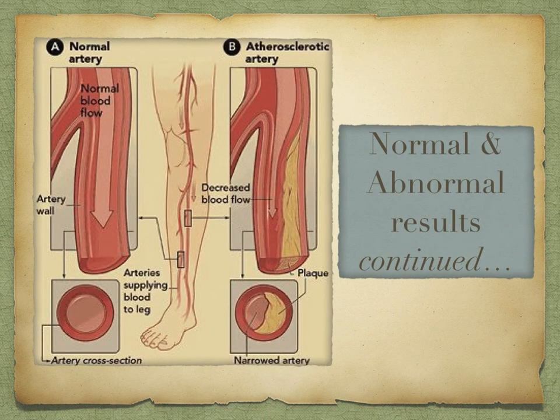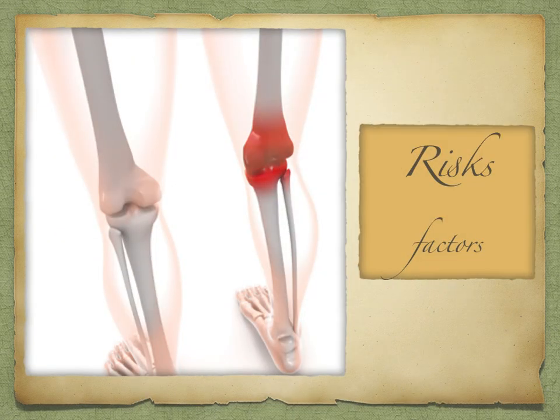A hot spot is when the radioactive tracer has accumulated within the bones, whereas cold spots are bone spots which don't have a lot of tracer accumulation. Cold spots can display a shortage of blood supply to the bone or certain cancer types. Hot spots can indicate problems such as arthritis, a fractured bone, tumors, or an infection. It is the patient's physician's duty to speak to their patient and discuss any abnormalities.